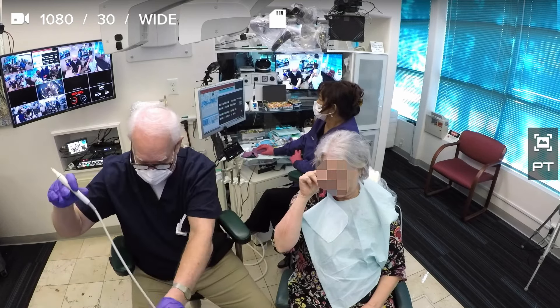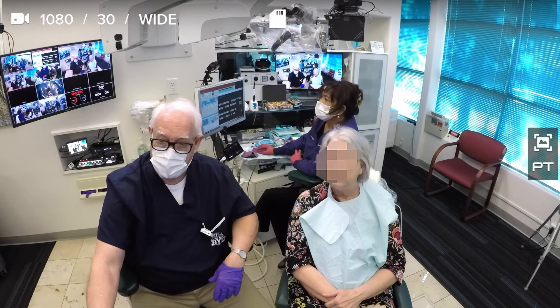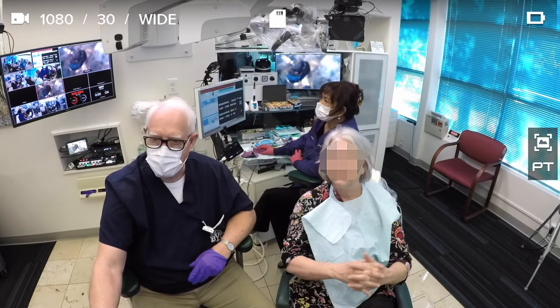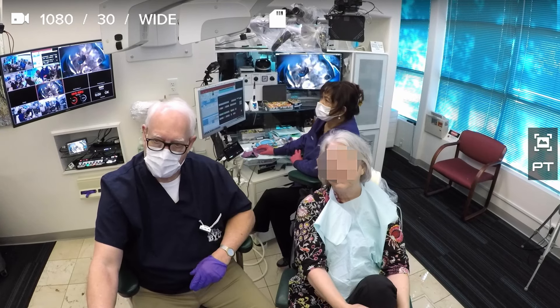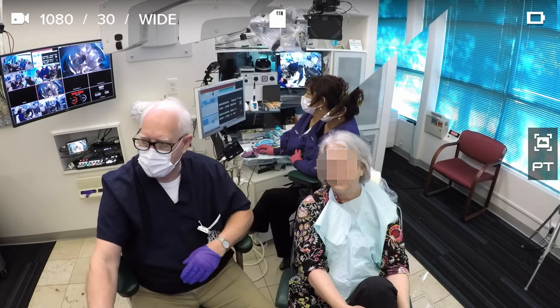I can show you actually what I'm looking at. So I take this sharp little tip and I trough around here. It blasts it away like concrete. So I'm in here. I have a pretty good idea — I think the center of it is maybe over here, and this one is probably right here. So now I have a pretty good idea of where to go. I'm taking that tip and just kind of sanding this back.